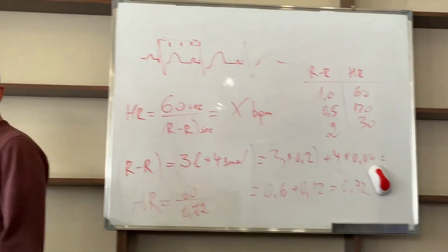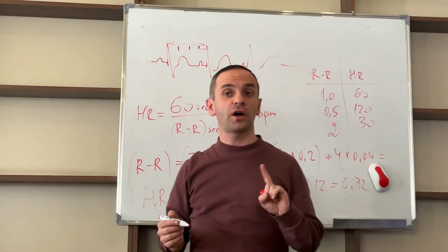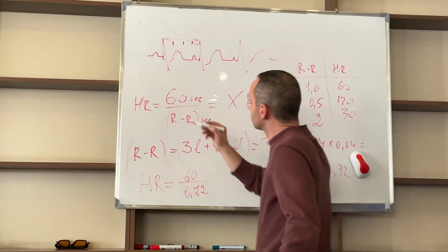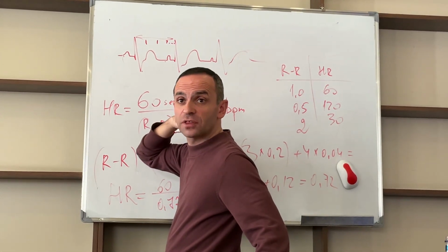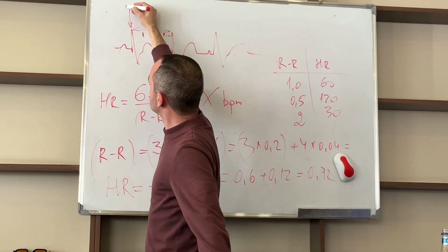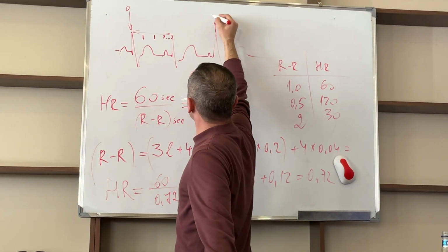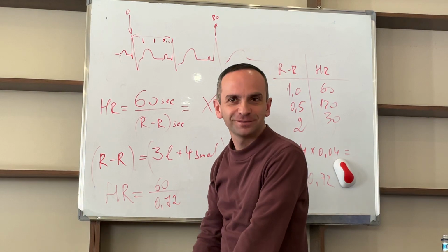ECG rulers. ECG rulers are used like this. It's usually written 2RR or 3RR, depending on which time. Let's take 2RR. It means that we need to have 2 RR intervals, in other words, 3 complexes: 1 RR interval, second RR interval. So 1 arrow is placed here, it is 0. And in front of the second arrow, you see a value, for example, 80. This will be the heart rate.